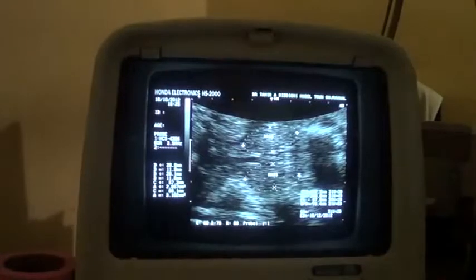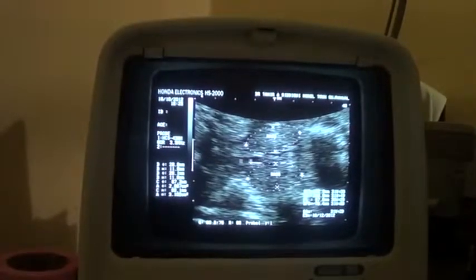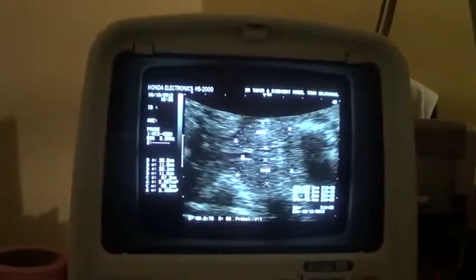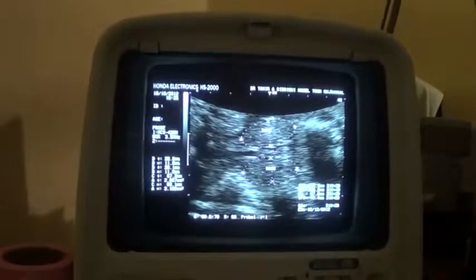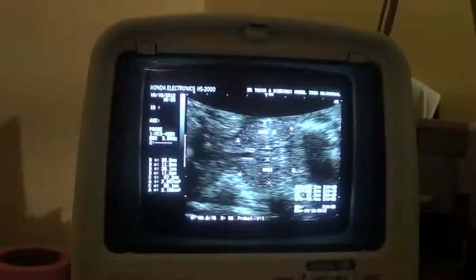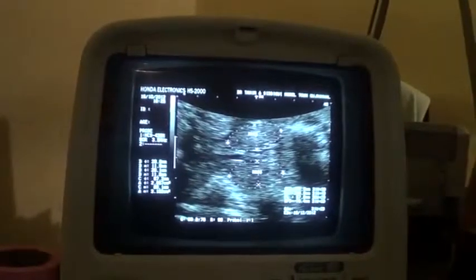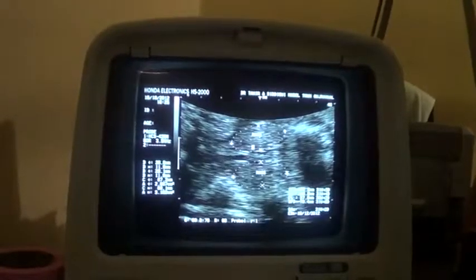And there is a vessel that is traversing through the center. If it had been a trachea, then in that case we should have been seeing air and the air shadow. There is no air shadow seen in this region. So this is a vessel entering the heart. The bilobe, evenly echogenic mass with no calcification or any cystic area within it. And this is neck mass, region of the neck.